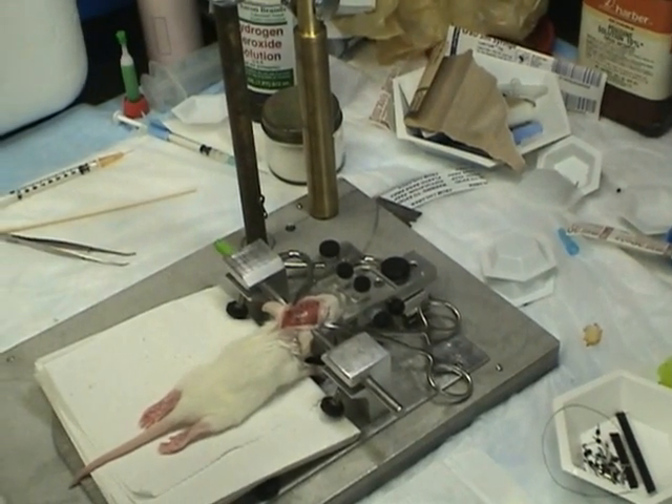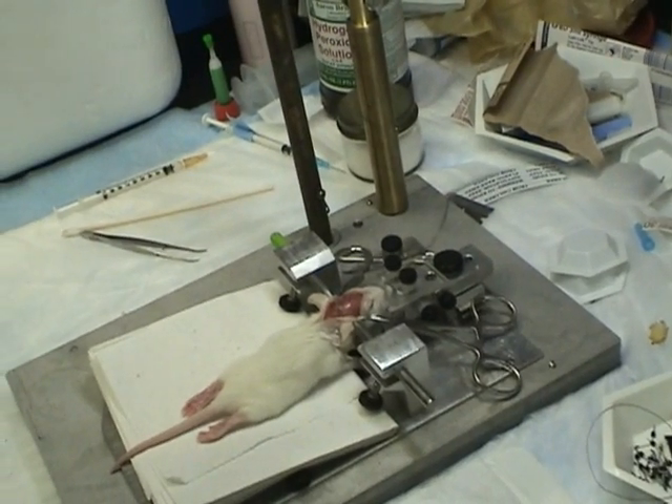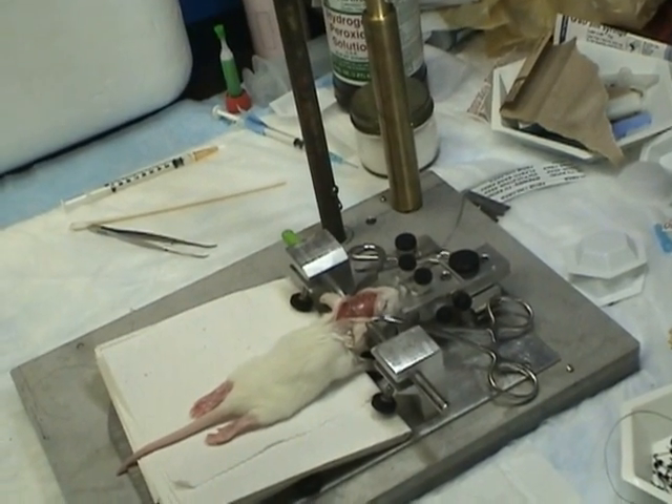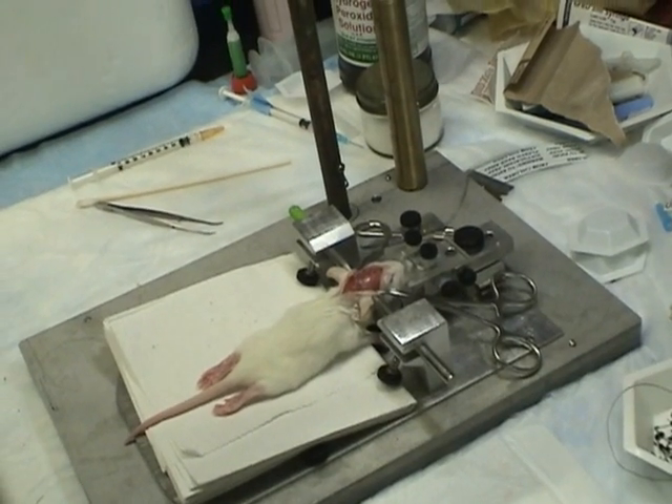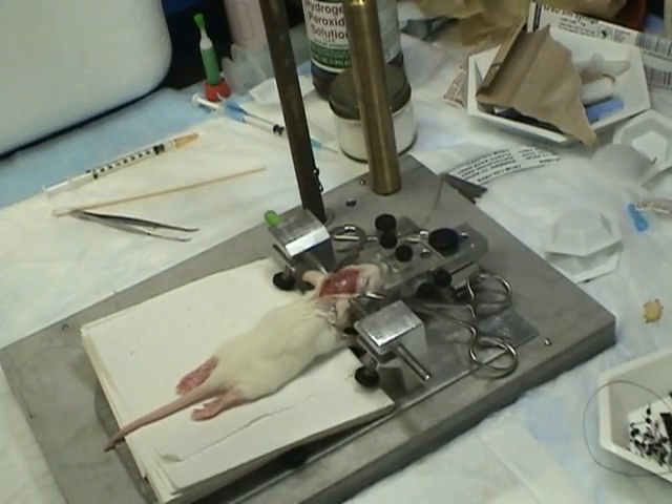The one I have right here. I know that you bring this from Korea, right? The small part? This tiny piece is from Korea, right? You couldn't find it anywhere at Radio Shack or somewhere here? I'm going to check the website and if I know, I will let you know.